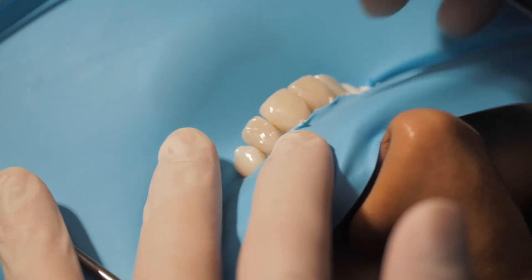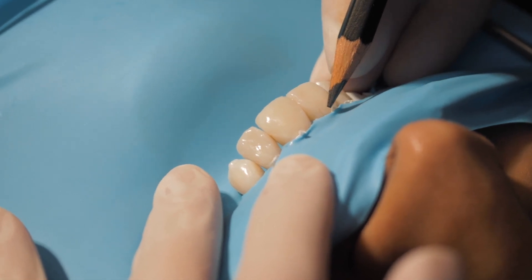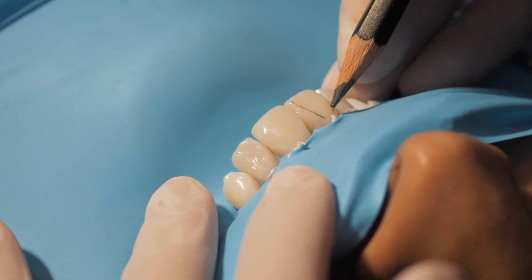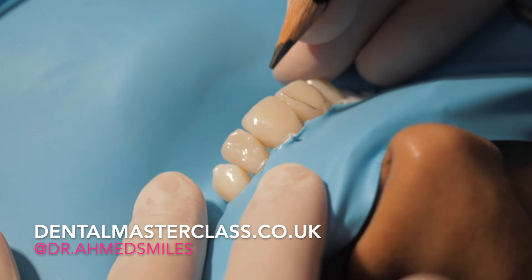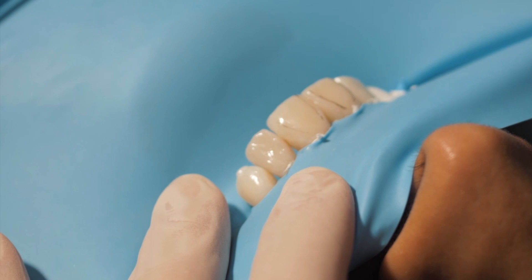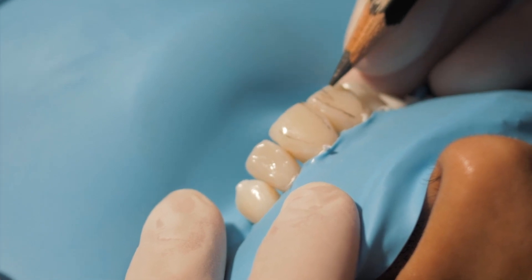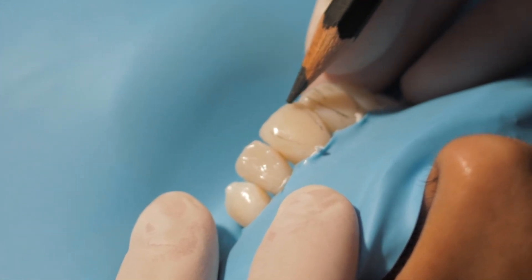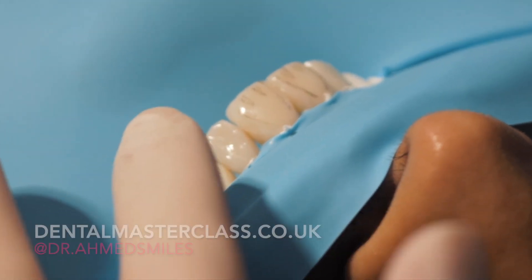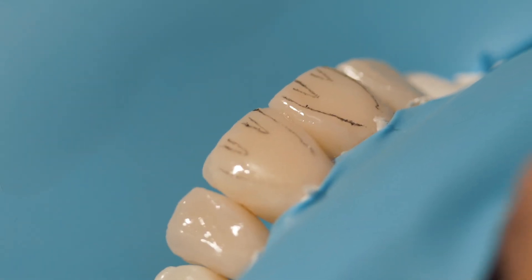I usually eyeball this — I don't draw — but you could get a pencil and start drawing your line angles: mesial, distal. That's your groove, there's another groove there. Secondary anatomy: these are the developmental grooves. We'll do this with the pencil and then I'll eyeball the lateral sizes.